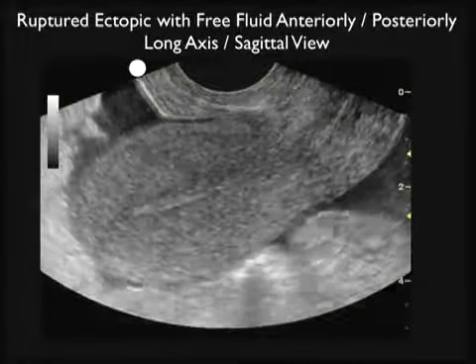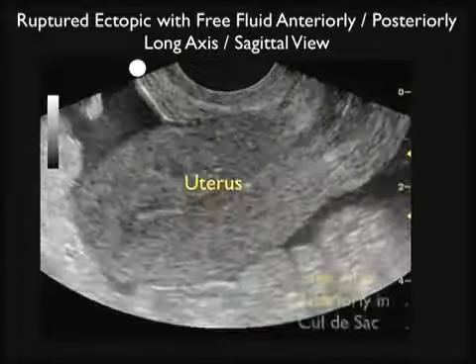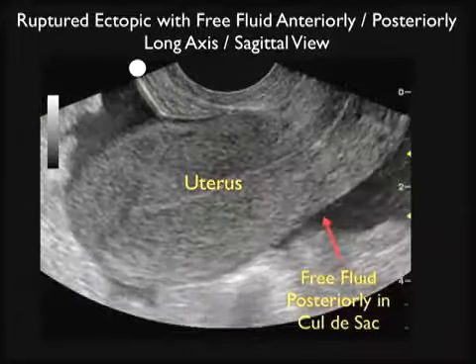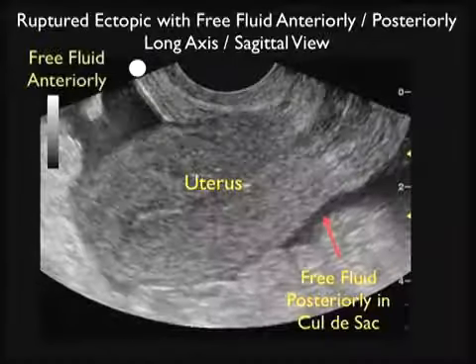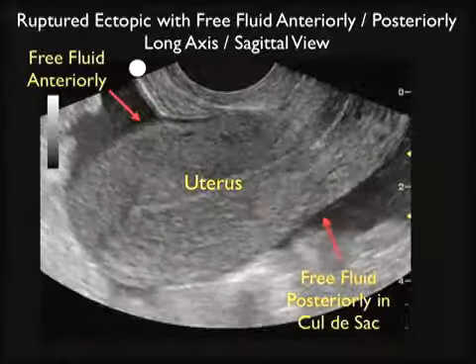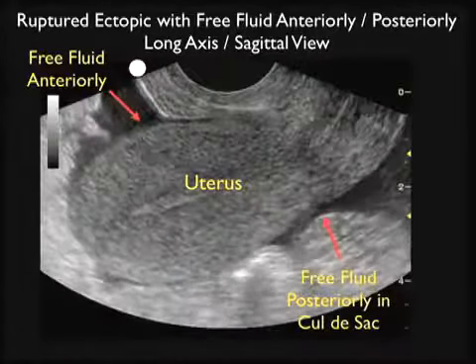What we see here is the uterus again in a long axis or sagittal plane. Notice the large amount of free fluid tracking both posteriorly in the pelvic cul-de-sac and flowing anteriorly there around the dome of the uterus to lie to the top portion of the ultrasound image. So a large amount of free fluid in another patient who had a ruptured ectopic pregnancy.